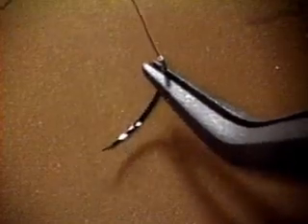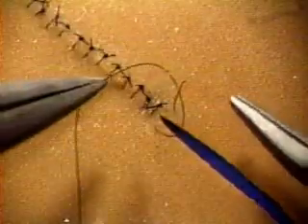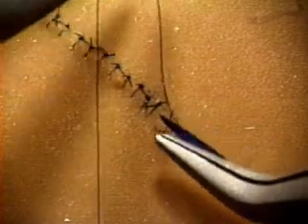In this tape, I'll show you every step and every pitfall in the deceptively simple process of basic microsuture technique. We'll look in detail at picking up the needle, passing it through the tissue, pulling the thread through, and last but not least, tying the knot.